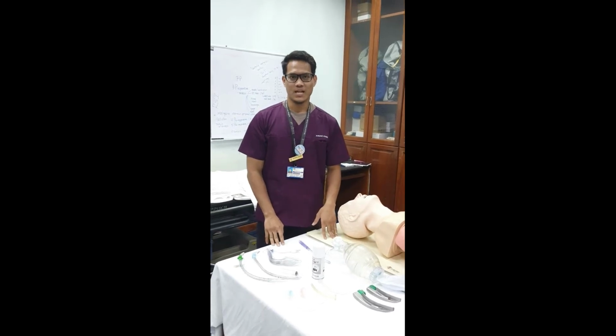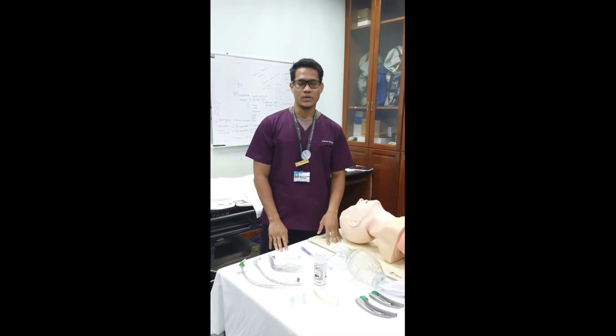Wabarakatuh. My name is Ahmad Zuhdi. Today I would like to show you how we do airway management.